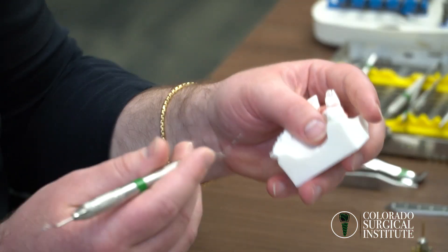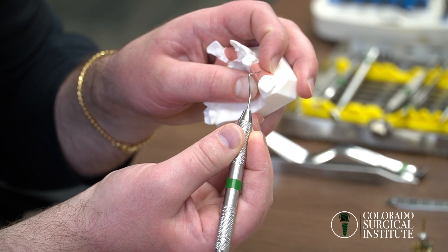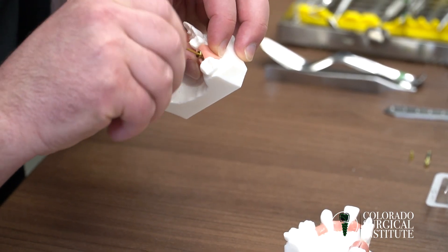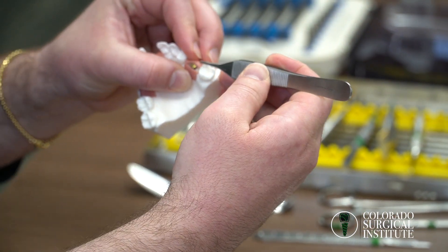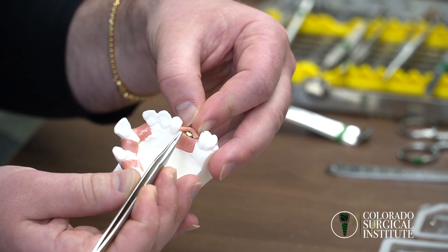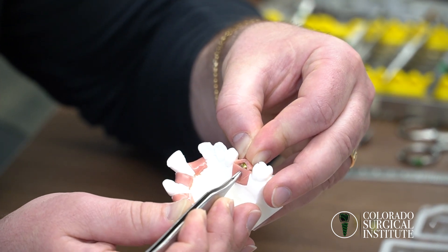A mistake we sometimes see, usually in the maxilla, is making an incision too lingualized. The good news is the bulk of keratinized tissue will cover the entire implant, but when you screw in your healing abutment and go to suture, the tissue gets bunched up over the top of the healing abutment. This creates spaces where bone can be exposed, and bacteria can get underneath — leading to a soft tissue infection and bone loss around the implant before it even heals.